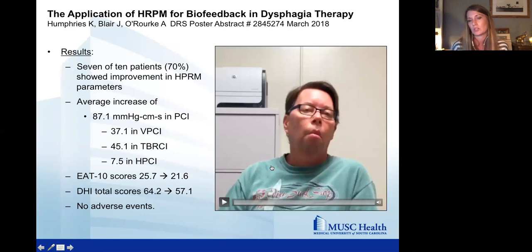But what we did is we took 10 patients, and they participated in our biofeedback pilot program. They attended one weekly direct therapy session using HRM-facilitated biofeedback for 3 to 6 weeks. We monitored their improvement, and subjects were discontinued in therapy once their individual goals were met and/or it was felt that they had plateaued in therapy. To summarize quickly, 7 of our 10 patients showed improvement in our HRM parameters.